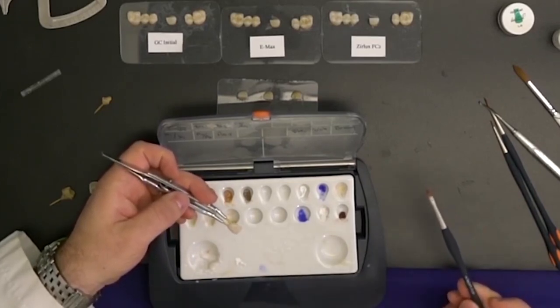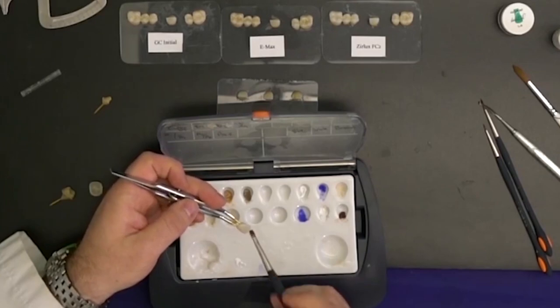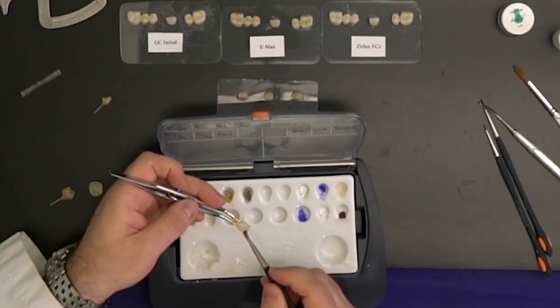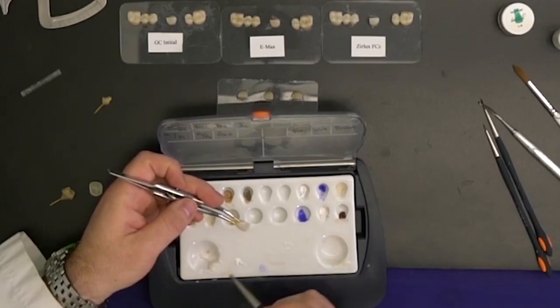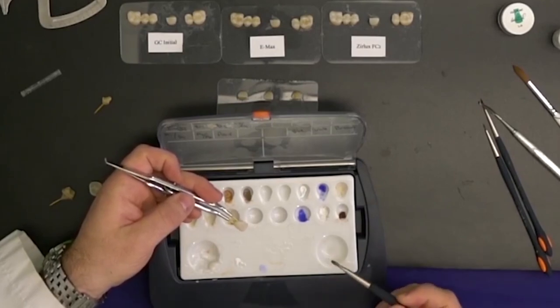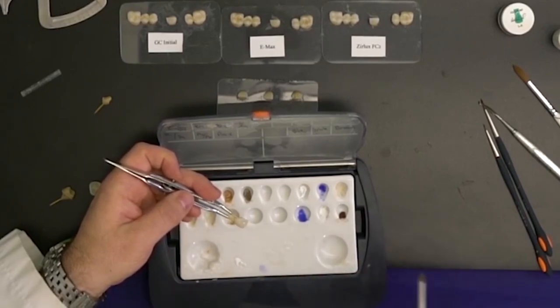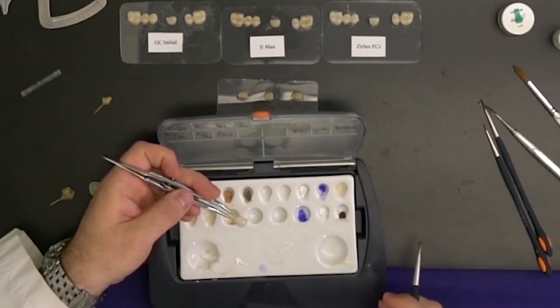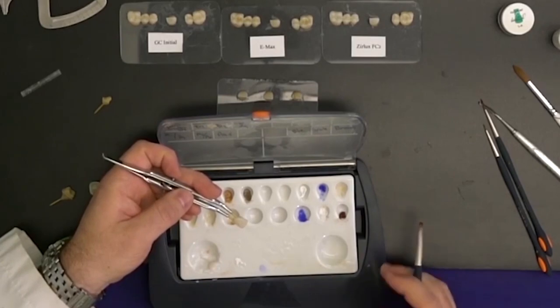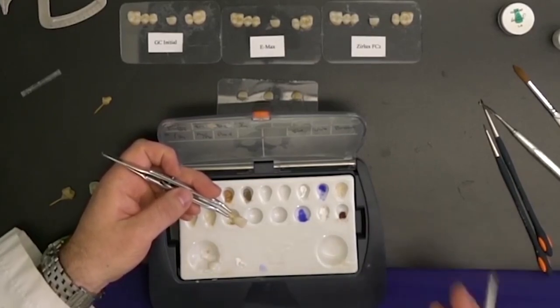One thing I like about these brushes — the Layer Art set — is they come in three sets, and especially this one: if you manipulate the neutral well enough, you can actually create surface texture as I'm doing right now. So the imbrication lines are already there and you can do that with the glaze. The valleys or developmental lobes always have a little bit more texture to them rather than the high spots, which tend to be at the height of contour as well as the mesiodistal and middle areas.